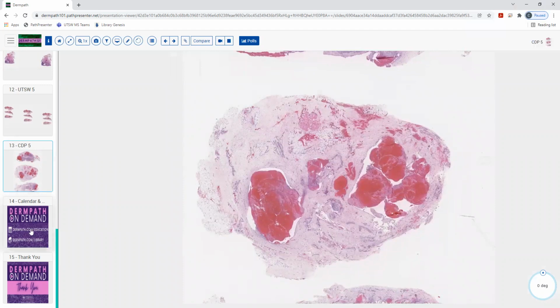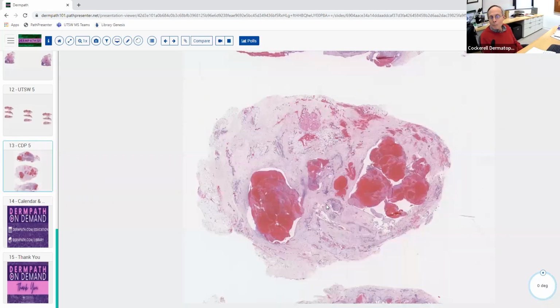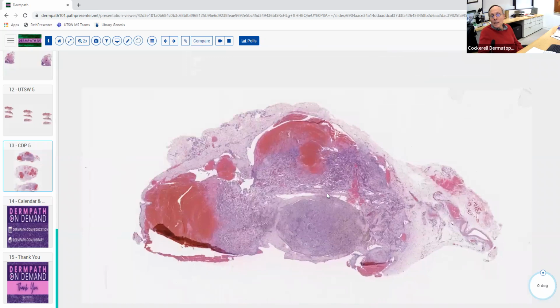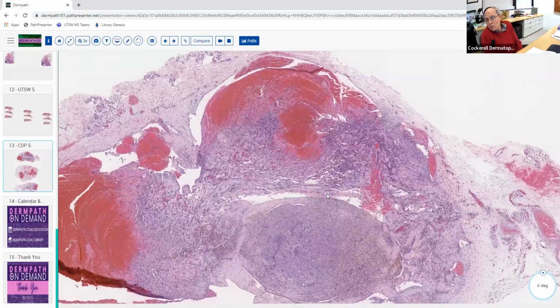Any questions? Wait, yeah, I have a question. So is Masson's, what is the formal name? Intravascular papillary endothelial hyperplasia, which is a pretty good name when you think about it, because it's in the blood vessel, intravascular. It is papillary like this. You can see those papillary-like projections, if you will. Intravascular papillary endothelial hyperplasia. So it's basically like granulation tissue. So it's sort of a descriptive name that people sort of took away from Masson, but a lot of people still call it a Masson's tumor. Just think of it as an intravascular pyogenic granuloma is the best way to think about it.